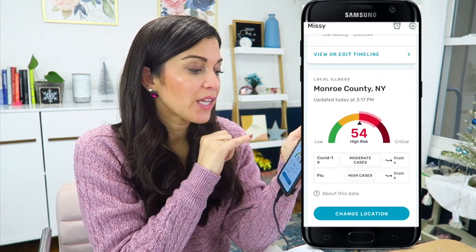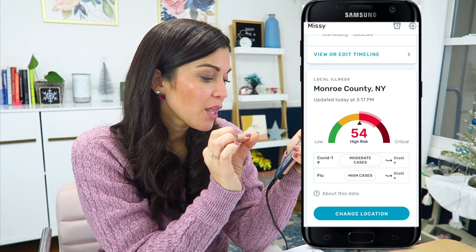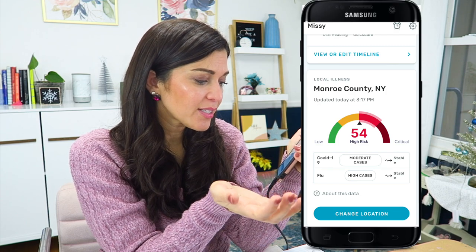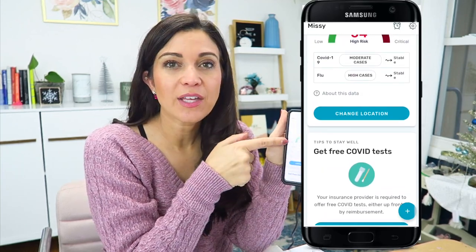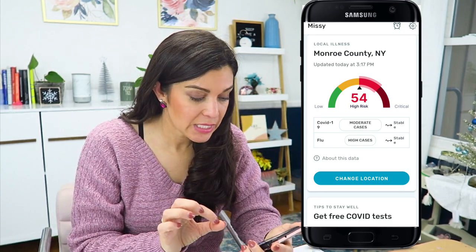So then it's going to give me a timeline of all of my symptoms. I live in Monroe County in New York, and it tells me that we're at a high risk of local illness. The COVID-19 cases is moderate risk — they're calling it stable — and flu is high risk and it's also stable. I don't know how something high risk can be stable, but okay. And you can change your location as well. I like the fact that you can change your location for a local illness. This is kind of cool because if you're traveling for the holidays or anything, you can definitely see what illnesses are high risk and high transmission in different areas. I think that's really cool.